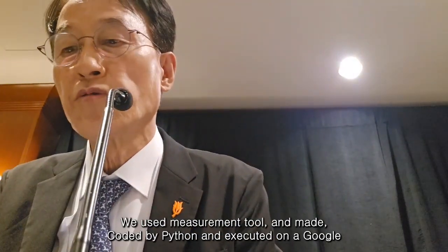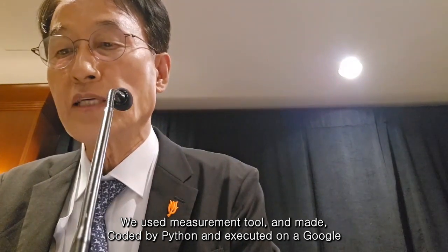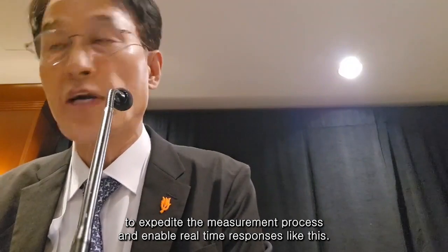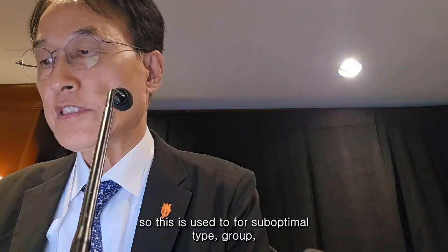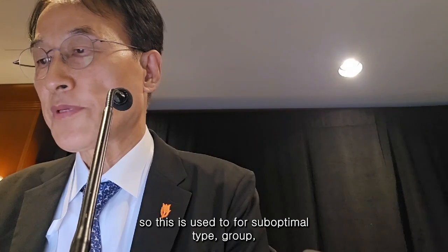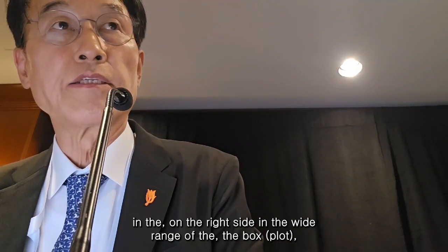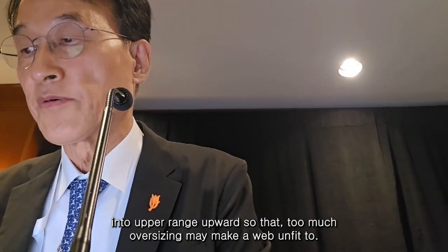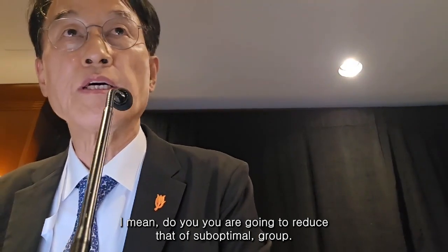We use a measurement tool coded in Python and executed on Google Colab to expedite the measurement process and enable real-time responses like this on the right side. Otherwise, it's very difficult to calculate in real time. So this is used for the suboptimal type group on the right side, with the wide interquartile range upward, so that oversizing may make the web unfit to the aneurysm. We are going to reduce that suboptimal group.